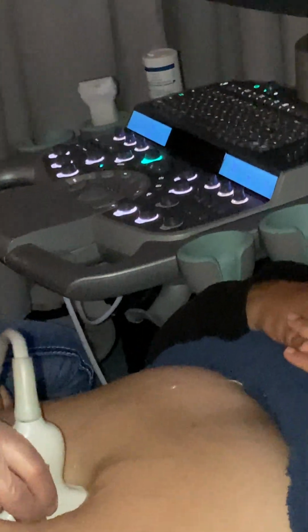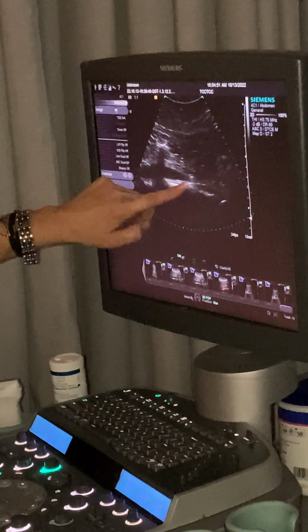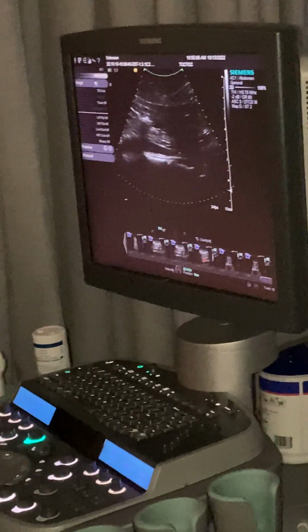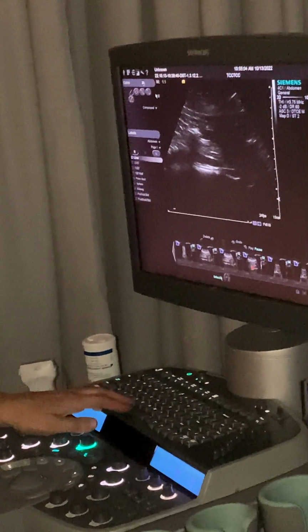Or you can go to this, so here's our distal. See how it's going to taper to an iliac? And is the bottom of my transducer more pointed to her left leg, which is right here, this is her left. It's very subtle. Or my transducer is more pointed towards her right leg. So in this case, it's going to be my sag right iliac.